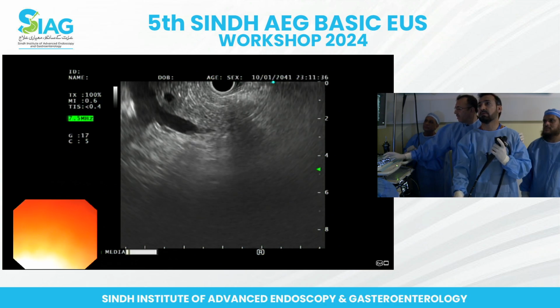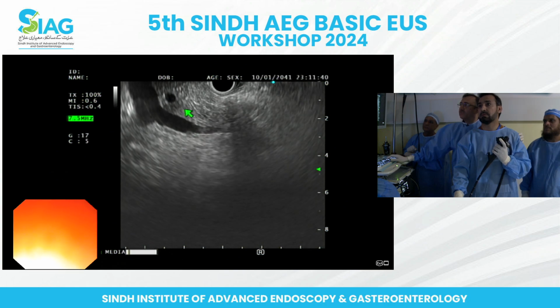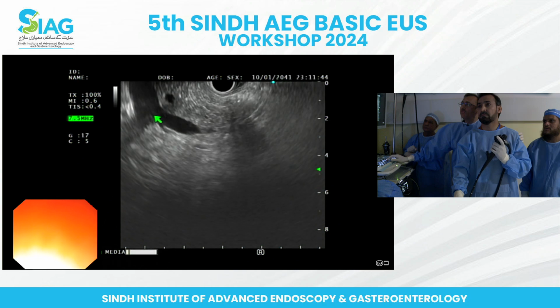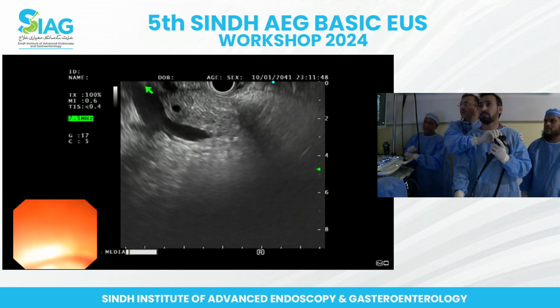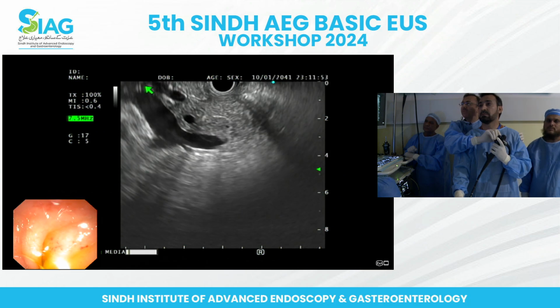Now here you have mesenteric. On top of mesenteric, it's all pancreas. Here it is splenic vein. This is confluence, and then this is portal vein. So big wheel slightly away from you, and that's how you bring the whole head of the pancreas right in front of you.